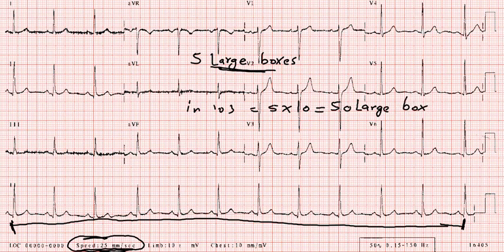And similarly in 60 seconds or 1 minute there must be 50 into 6, 300 large boxes. Got it? I wanted to imprint that 300 in your mind.